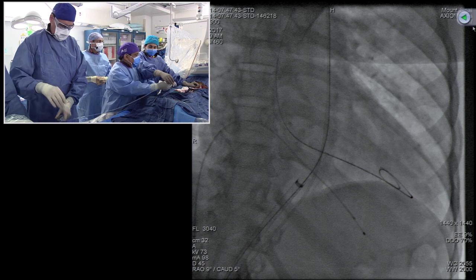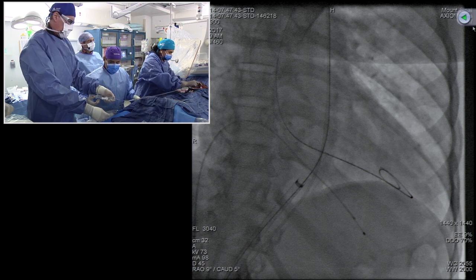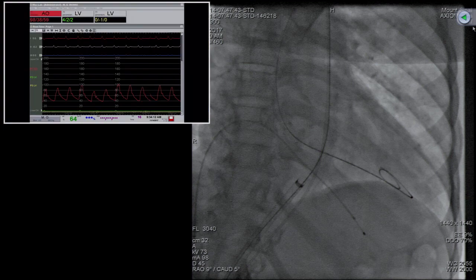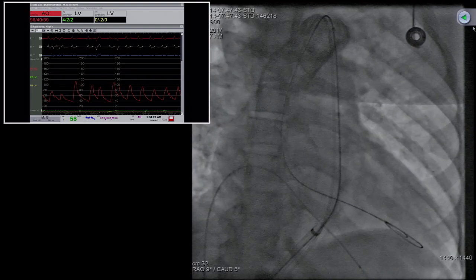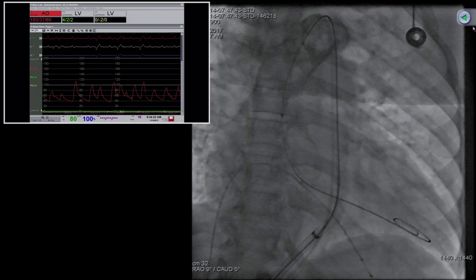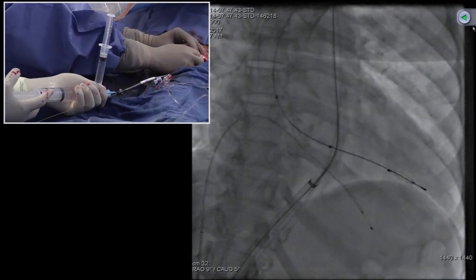Yeah. ZMED. Wow. Only 18? I know, yeah. We are also asking. I mean, whoa. Well, make sure you inflate fully. All right, we are doing a pediatric balloon valvuloplasty. That's right. Okay, well, let's see. No pacing, just go up.